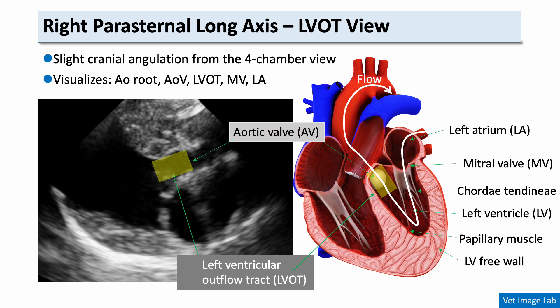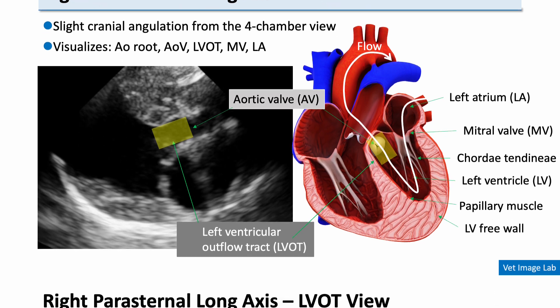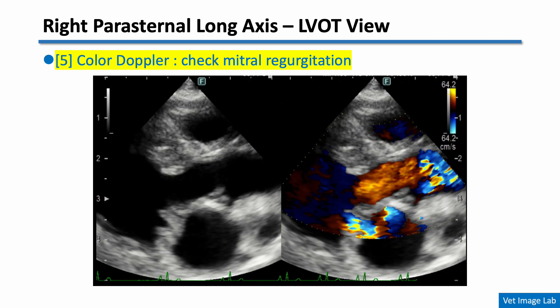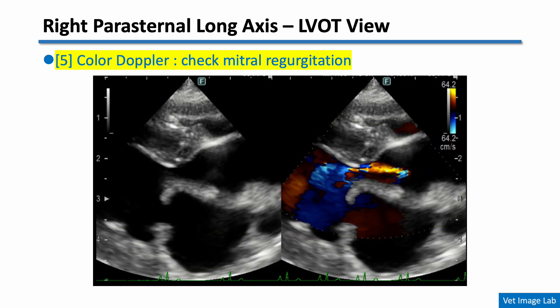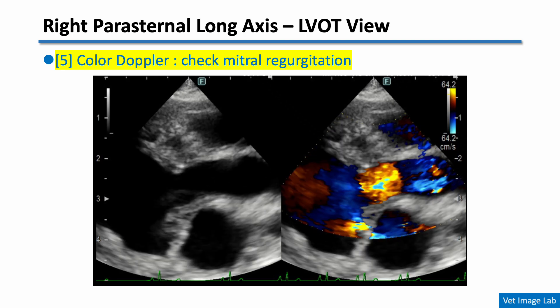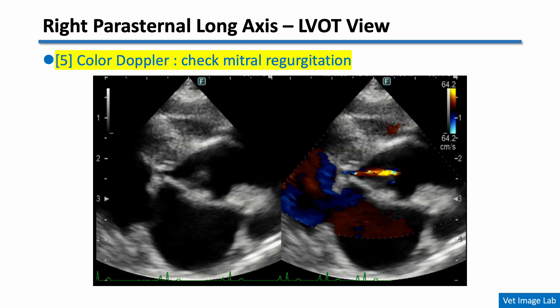Now let's take a look at the right parasternal long axis LVOT view. This view is obtained by applying a slight cranial angulation from the four-chamber view. This window clearly shows the aortic root, aortic valve, left ventricular outflow tract, mitral valve, and left atrium. In this LVOT view, just like in the four-chamber view, you can also evaluate mitral regurgitation using color Doppler. The regurgitant jet is again visible as a mosaic flow into the left atrium.